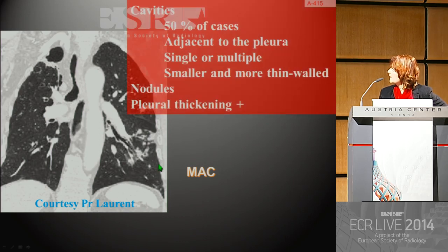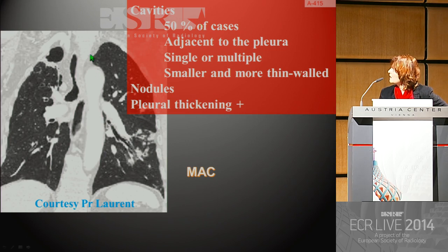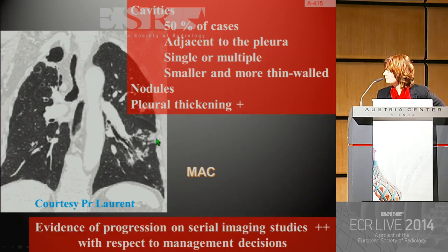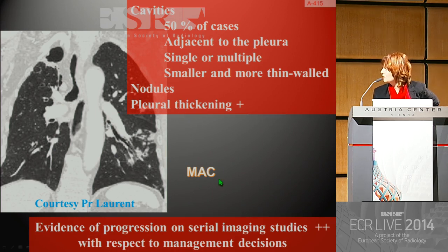Here is an example of a classical form of non-tuberculous mycobacterial infection. You can see cavities associated with nodules — a typical presentation. Cavities are seen in 50% of cases; in most cases they are adjacent to the pleura, may be single or multiple, bilateral, and are frequently smaller and thinner-walled than those seen in TB. Pleural thickening may be seen; conversely, pleural effusion is rare compared to TB. Evidence of progression on serial imaging studies is very important with respect to management decisions, as was the case in this patient proven to have a MAC infection.